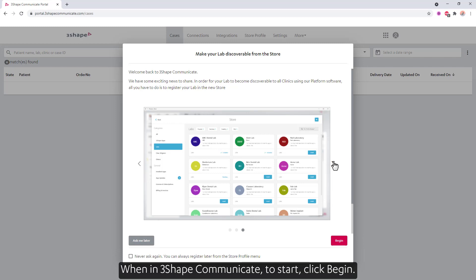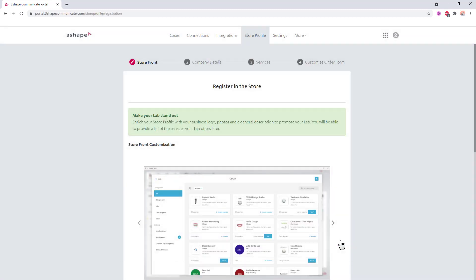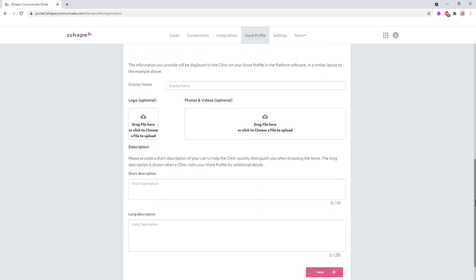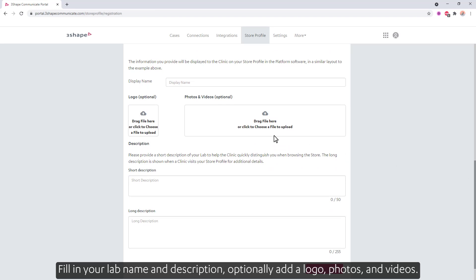When in 3Shape Communicate, to start, click Begin. Fill in your lab name and description, optionally add a logo, photos, and videos.